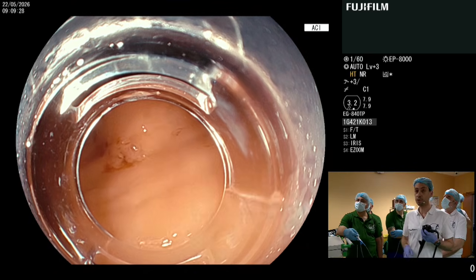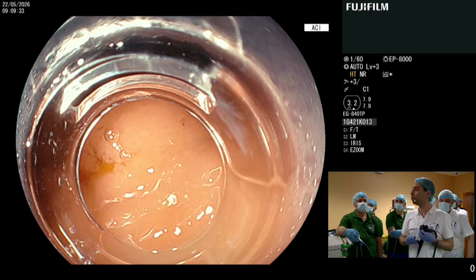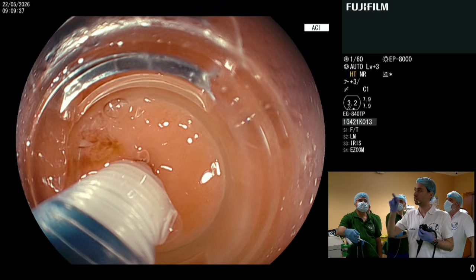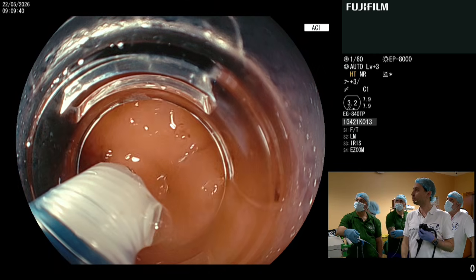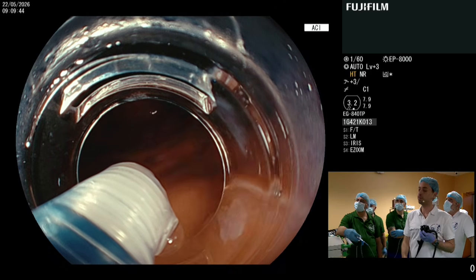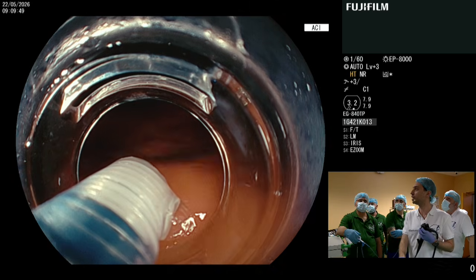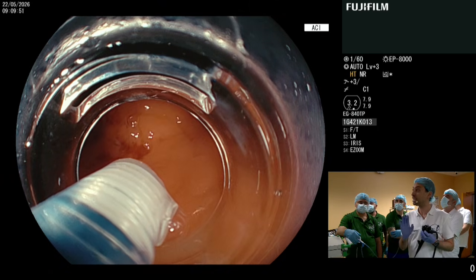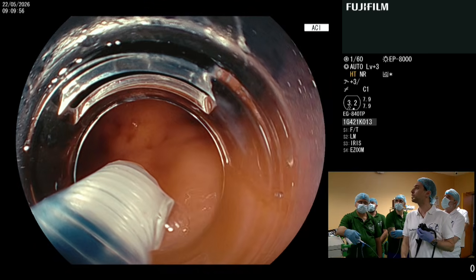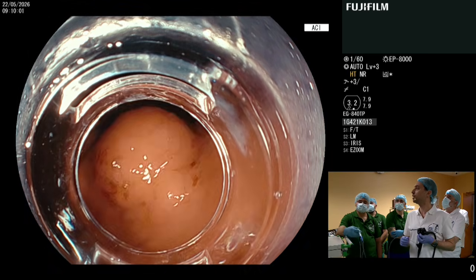Now, we have two options. One, to do a longitudinal incision, which is easier to close, or to do a horizontal incision, which is more difficult to close, but gives us faster access to the lesion. Another choice we have to make is whether we will start the tunnel 3-4 centimeters more proximally. This is best for the esophagus, or we start close to the lesion, because in the stomach we can easily get lost and search for the lesion for hours. So I will start my incision here. Please give me the injection needle.